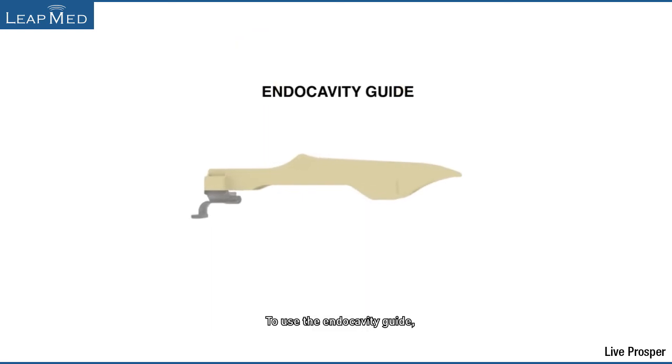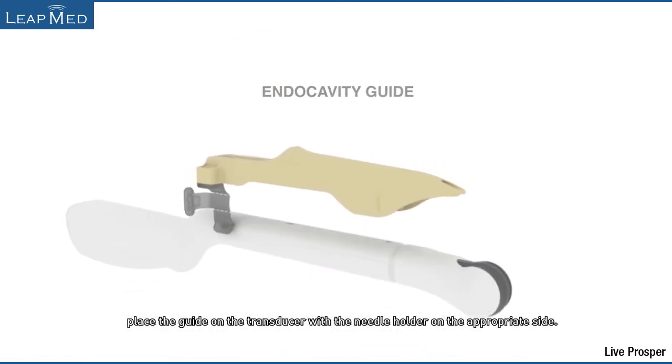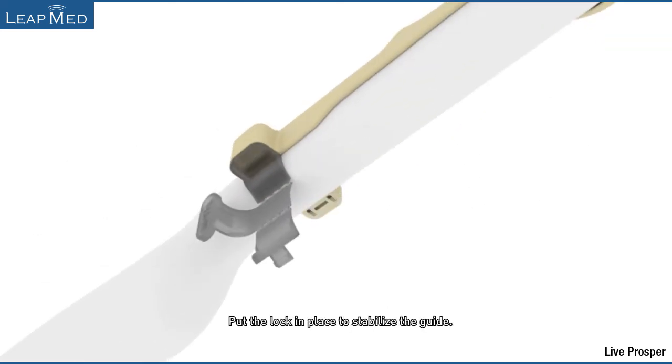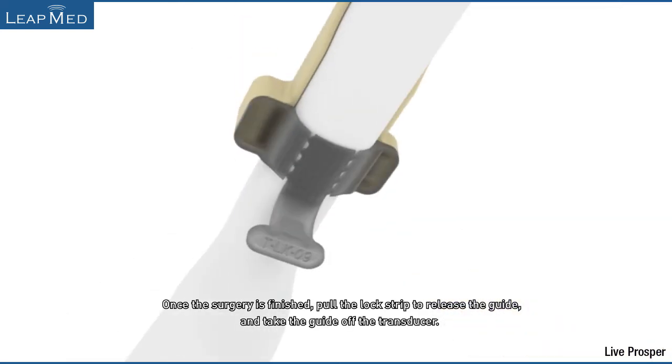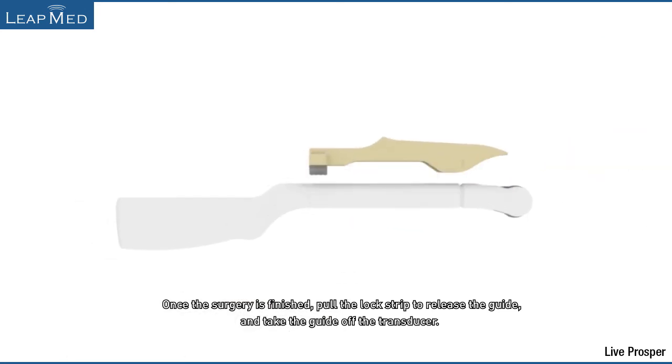To use the endo-cavity guide, place the guide on the transducer with the needle holder on the appropriate side. Put the lock in place to stabilize the guide. Insert the needle. Once the surgery is finished, pull the lock strip to release the guide and take the guide off the transducer.